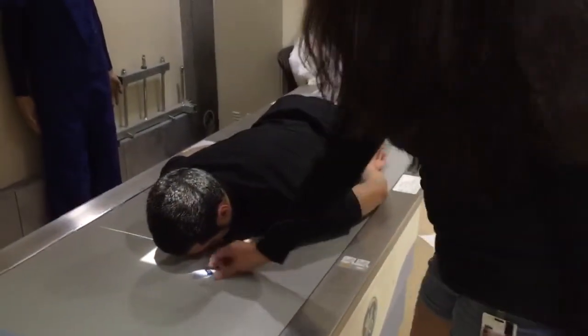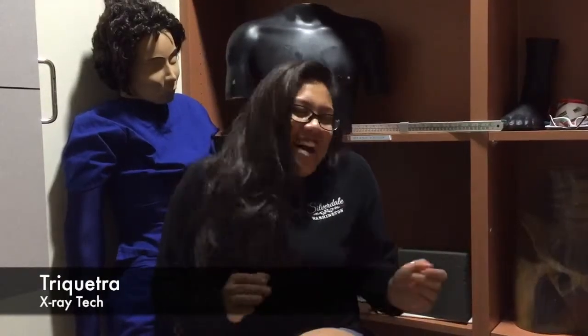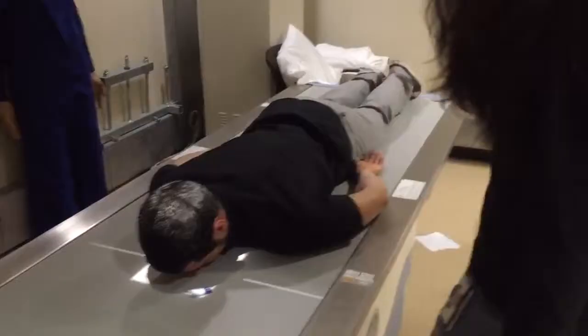Now you just gotta make sure you put the marker right there in the light. Go shine a little light. This little light of mine. No. I'm gonna let it shine.